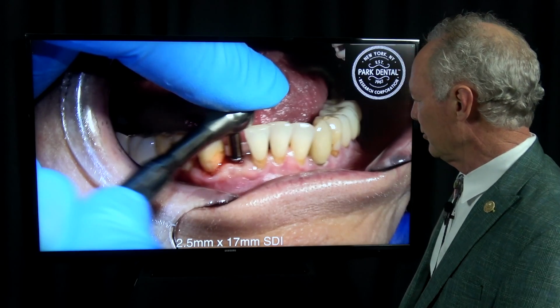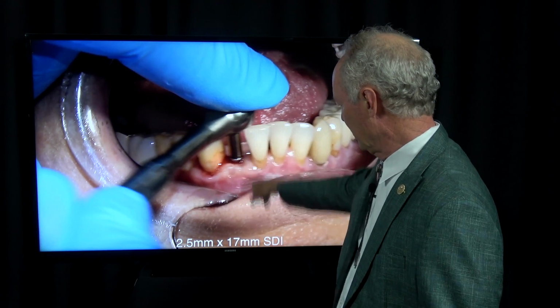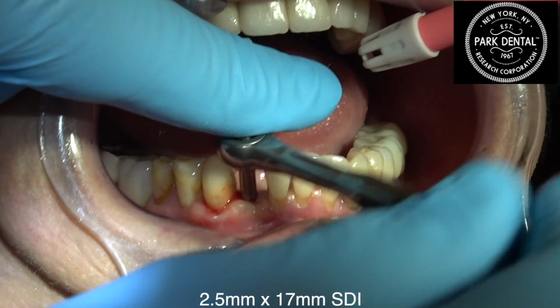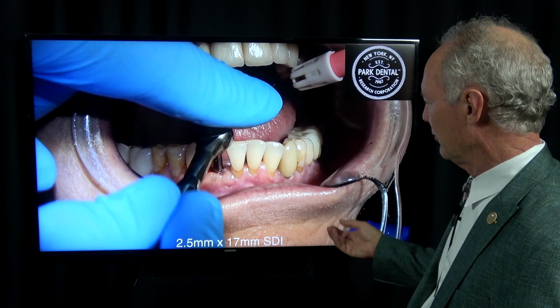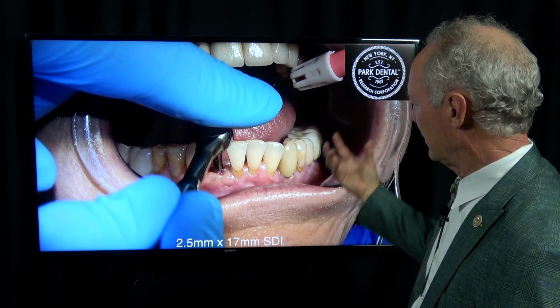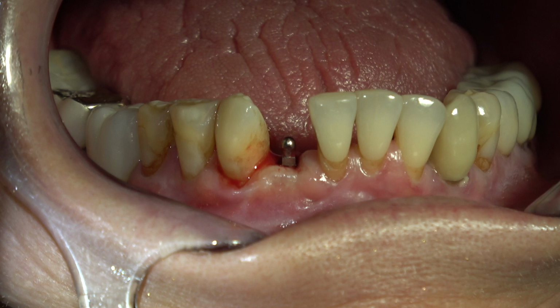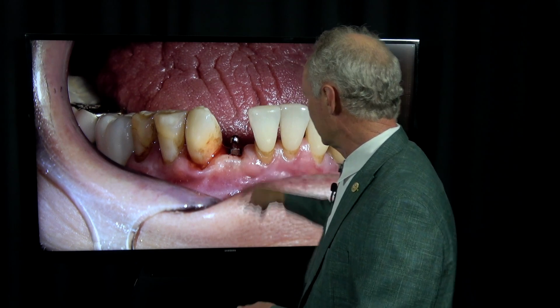So how far do you want to screw this in? I want the shoulder to be right at the gingival line. Now you can use two different types of small diameter implant. One is a ball clasp implant, and I mean it has a ball on the top, and the other one is for crown and bridge. Either one of them will work. So this has a ball, so I've got the shoulder right at the gingival line.